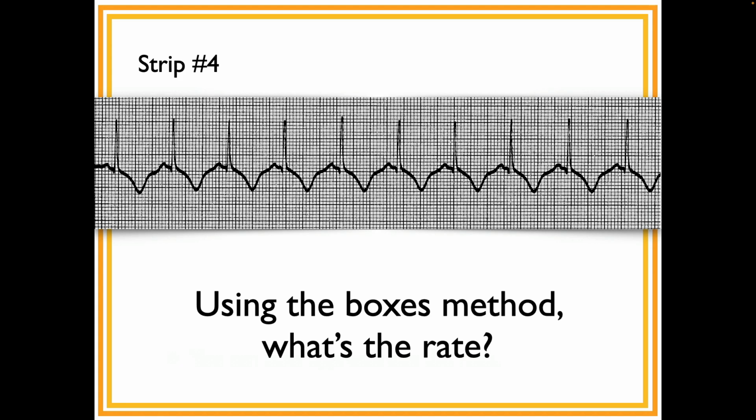Okay, who's got it? 90. Okay, so which one did you use? Okay, go ahead, Cohen. Started right here, it's like right next to the line. Then 300, 150, 100, 75, and it's closer to 100, so I estimated it to be 95. Yep, 90, 95, okay? And how good do you have to be? You have to be within about 10. So if we're getting answers that are wildly different, then we need to get a little better.